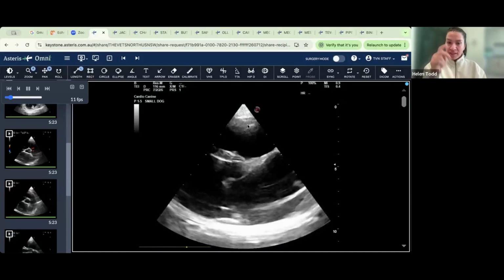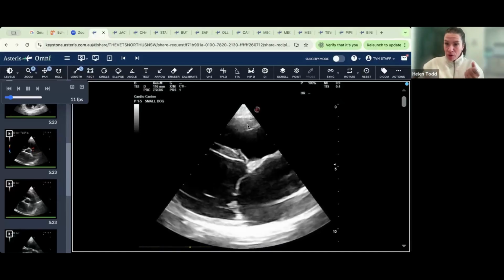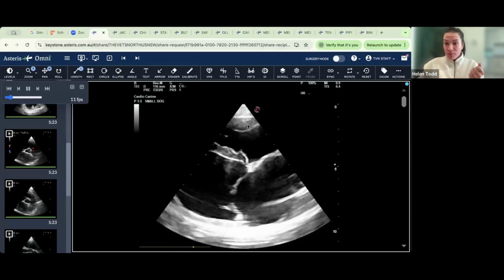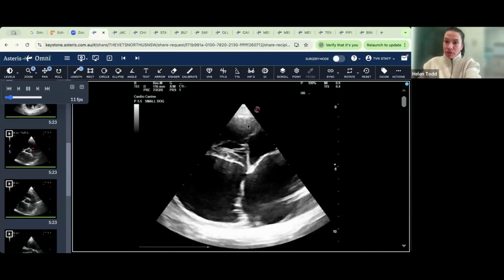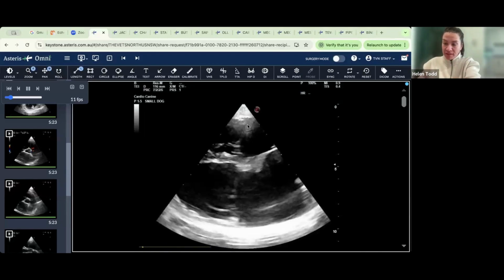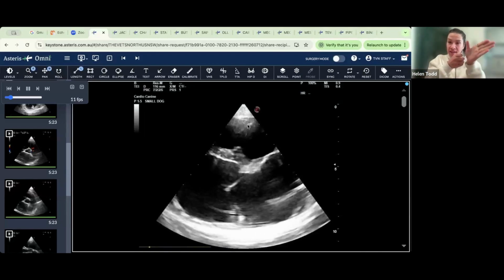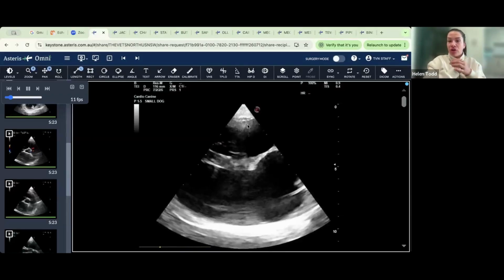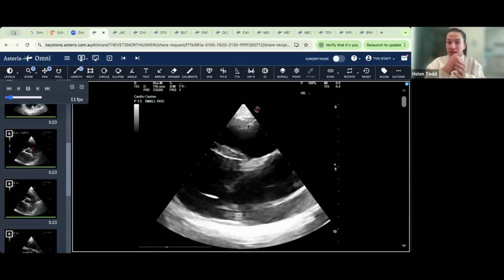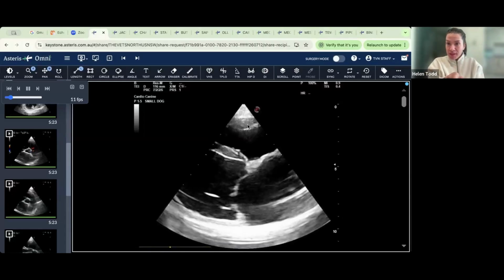Now, why that's important is if you don't have a cardiac probe in practice, you can absolutely practice cardiac views with an abdo probe, but you either need to tell the machine to flip the image, so make sure the E is the other side, or instead of your light of an abdominal probe or your notch facing cranially, you're just going to rotate it around so it's facing caudally, so your image is flipped.